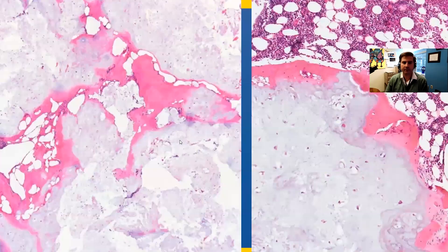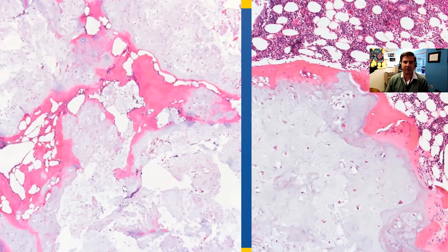Tissue is obtained. Here we have an intermediate power view showing a hyaline cartilage neoplasm that is low-grade. The cells of interest are small, condensed, and lymphocyte-like. They are fairly evenly spaced out, and the periphery of the hyaline cartilage neoplasm is ossified.